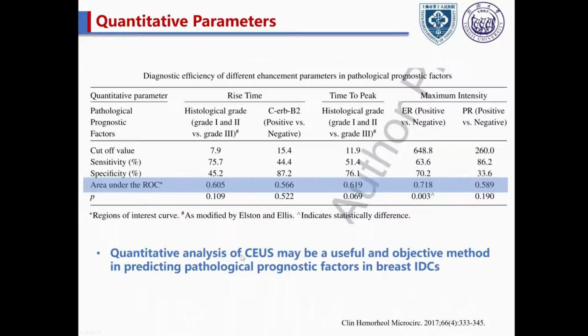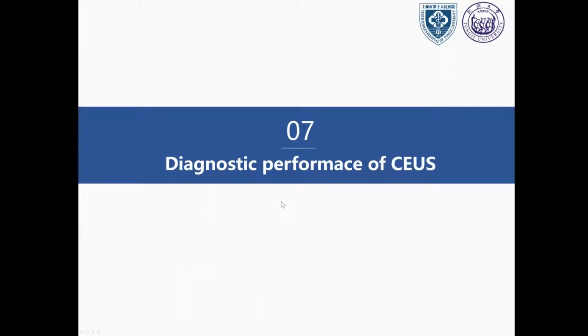And quantitative CEUS may be used as an objective method in predicting pathological prognostic factors in breast carcinomas. However, I think it is at a very preliminary stage. We cannot get any conclusion about the use of quantitative CEUS. So, how about the diagnostic performance of CEUS in breast?